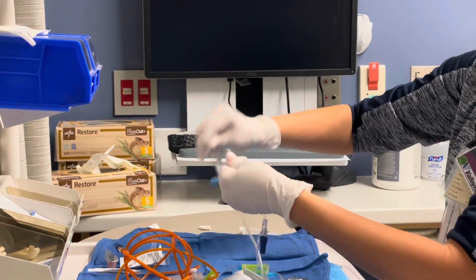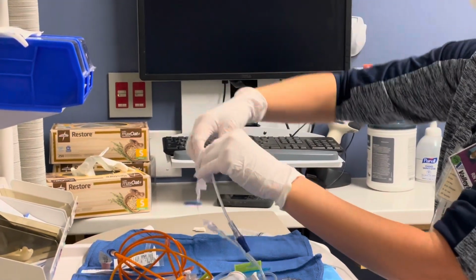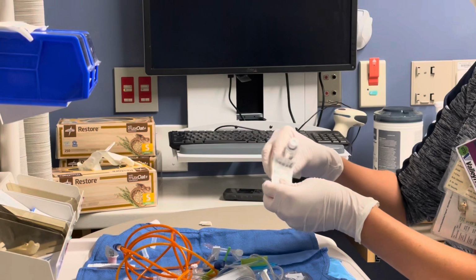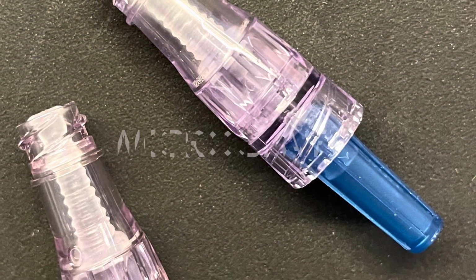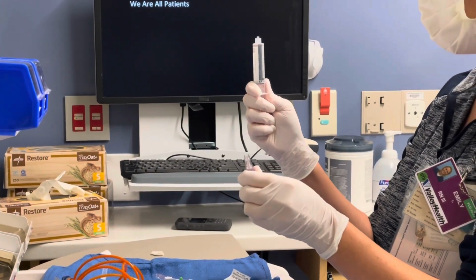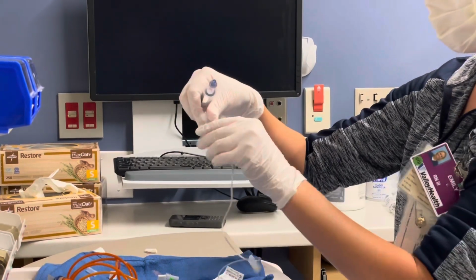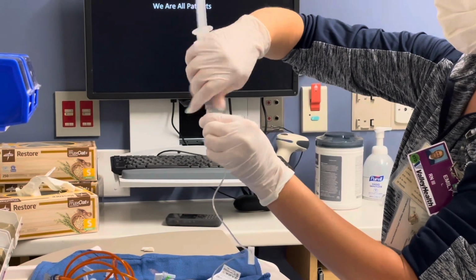Pay close attention as Emily is not touching any of the open ports. This is our microclave, which creates another barrier to decrease the risk of infection. It has a microbial barrier design, which minimizes the entry points for bacteria. For your IV medication tubing, you will have a microclave on either end. This is a high access area for medication entries, and this will decrease the infection risk.